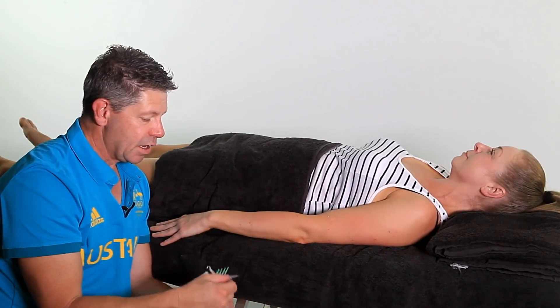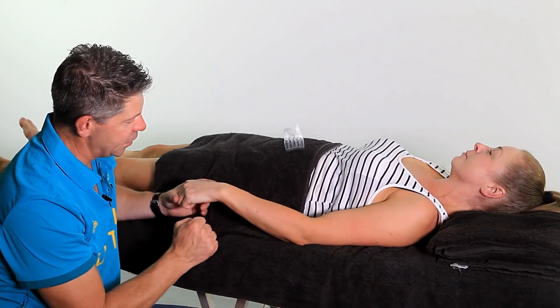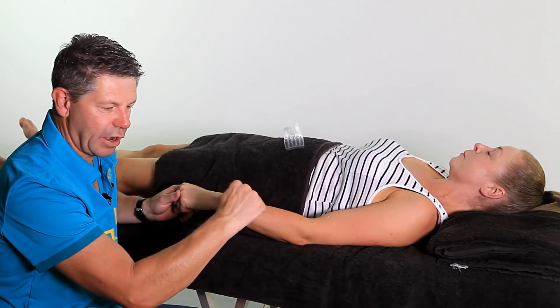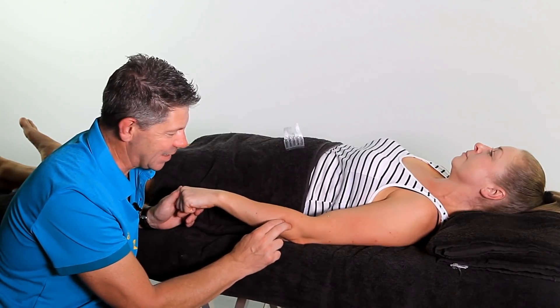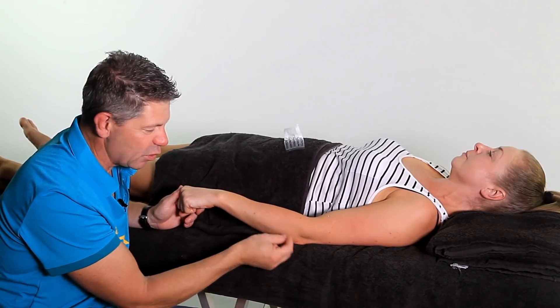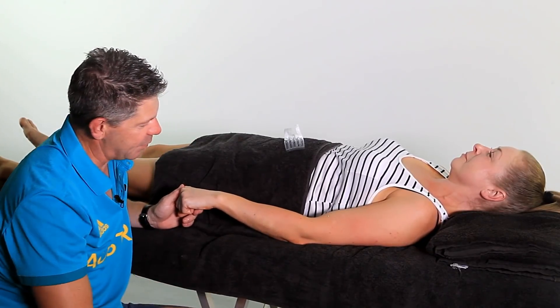Finding the extensor carpi ulnaris is quite simple. Get your clients to make a fist and then get them to ulnar deviate — so they're going to go out like that. You should feel the muscle contract as they do that; that's how you'll know you're on extensor carpi ulnaris. The ulnar bone is right here, so we're not going to needle that — we're just going to stick to the soft tissue of the extensor carpi ulnaris.